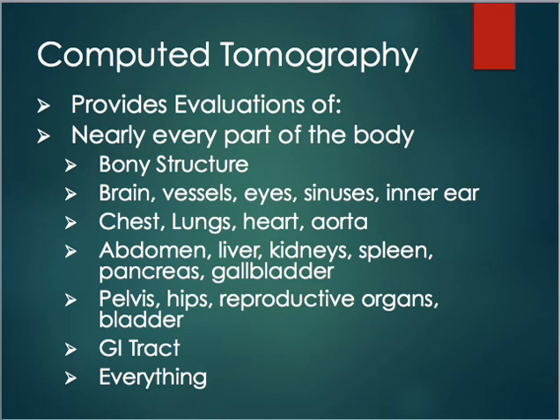It's good at evaluating the chest, lungs, heart, and aorta, abdomen, liver, kidney, spleen, pancreas, and gallbladder, so all of the abdominal organs. It's also great at looking at pelvis and hips for fractures or injuries, reproductive organs, and the bladder. And it's good at looking at the GI tract. So essentially, CT is really good at looking at everything.